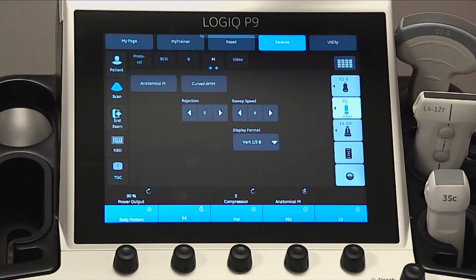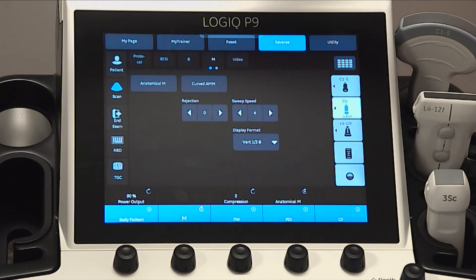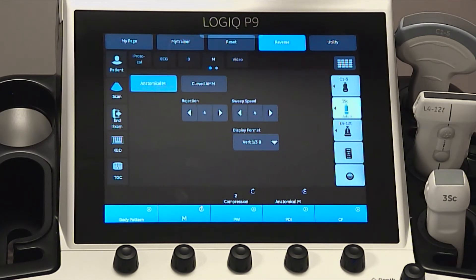The touch screen has many parameter options. Some of the most common options you will adjust in motion mode are anatomical M mode, which gives you the ability to manipulate the cursor at different angles and positions. Curved anatomical M mode displays a distance and time plot from the free drawn cursor line.